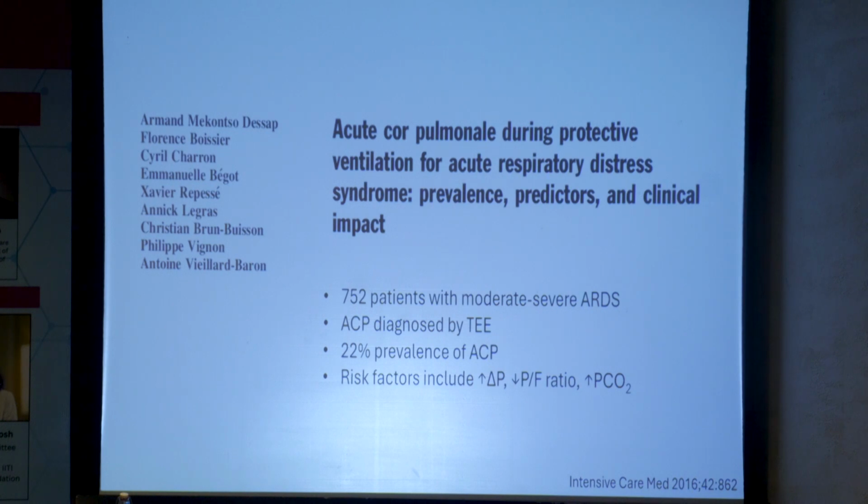So what do you do with that hole in the vein if you remove the cannula? He's asking what you do to allow the hole in the vein to heal when you remove the cannula. Or, let's say you have dilated it, you have put the guide wire, keep dilating, you are up to say 25, and suddenly your guide wire comes out, you have lost the track. What are you going to do? Cut down. Not necessary at all. You just close the skin. Put some pressure, it's venous pressure, close the skin.